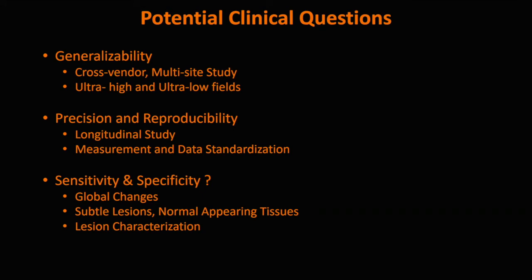This high precision and reproducibility can also be used for measurements and data standardization. So hopefully, once this quantitative MRF scan is implemented in different vendors, we'll be able to get more standardized data and build a bigger database for quantitative analysis.